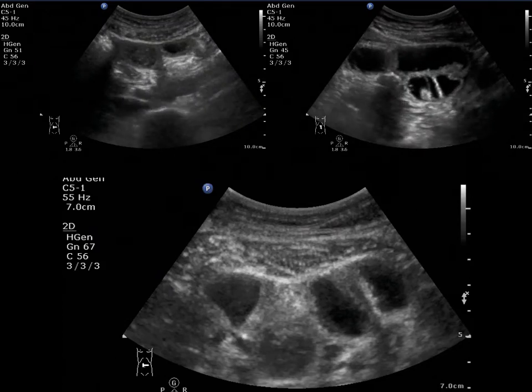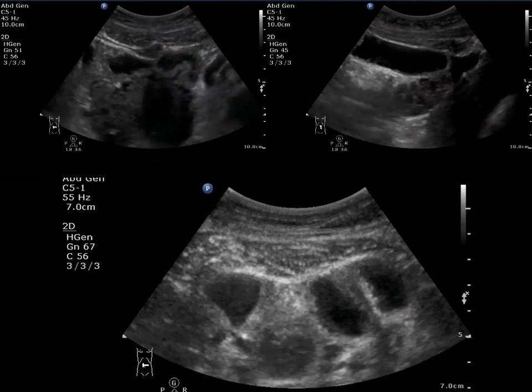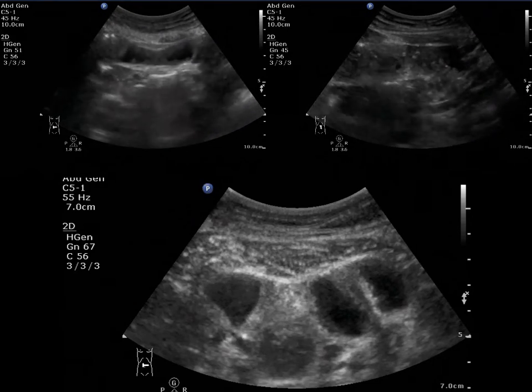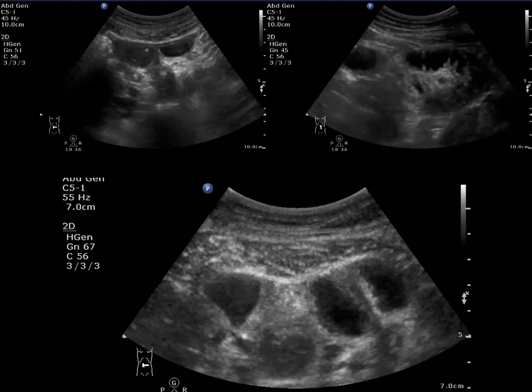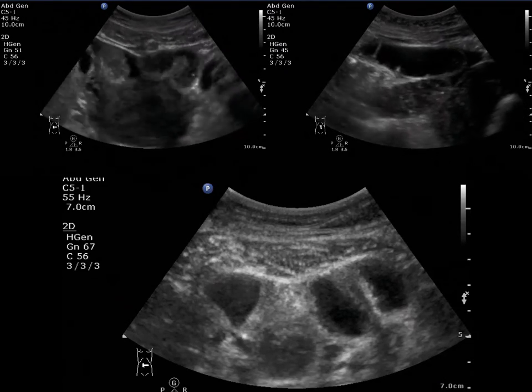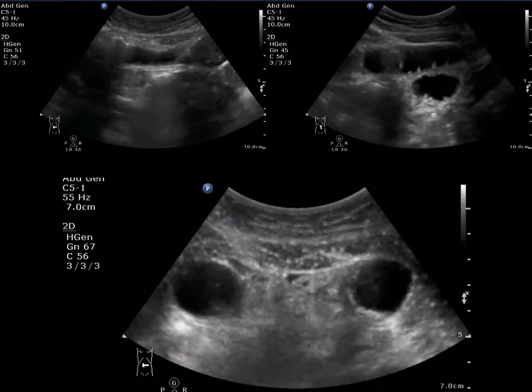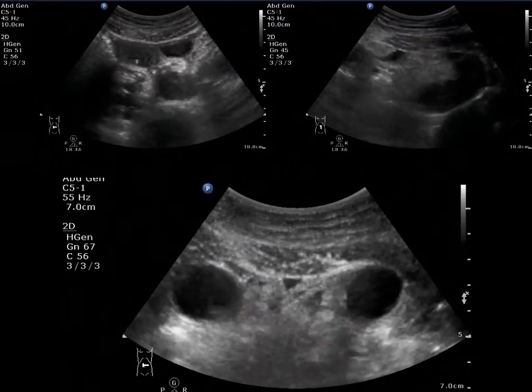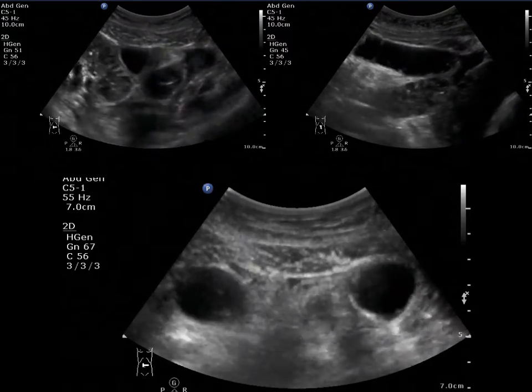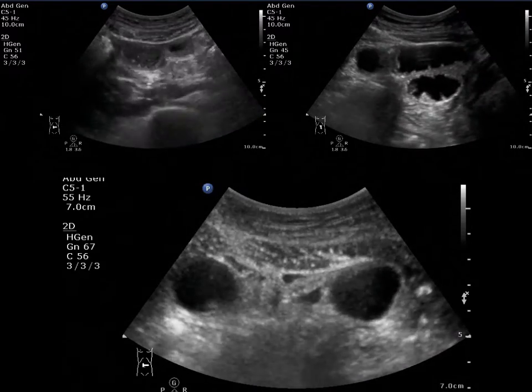This is dilated small bowel loops. We can find some collapsed bowel loops in the regions far away. This patient had abdominal surgery previously, so we can diagnose that this patient may have adhesion ileus. It is not so common to find the adhesion band, a fibrotic band, causing this problem, so it is not a routine procedure to find that.